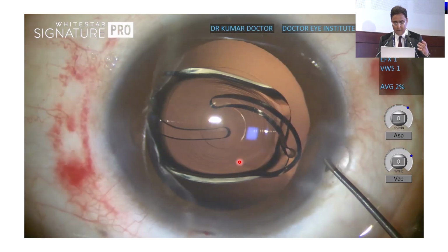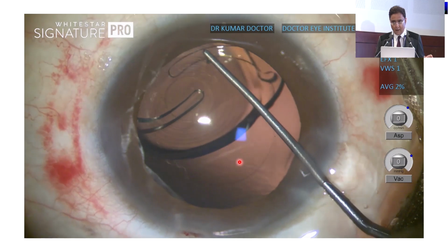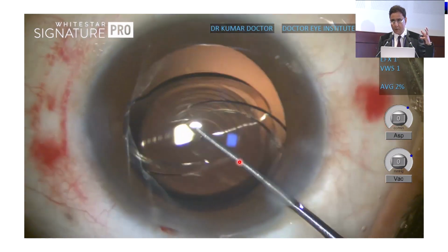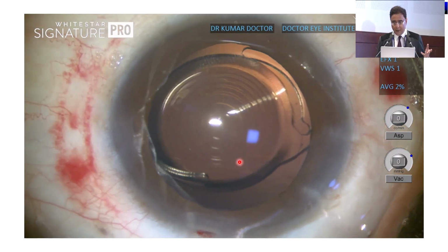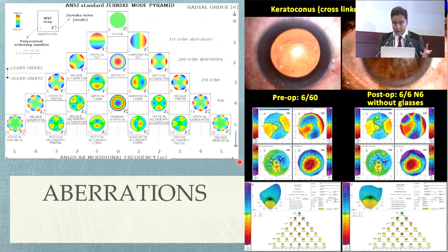Those who don't have it will say not necessary. But I've been doing femto now for 9 years, and if I had my own eye, I would definitely do a femto because IOLs center automatically. The rhexis is made in the center of the bag. When you put the IOL in the bag, the IOL just centers. You don't need to nudge it to center it. So aberrations are very, very important.